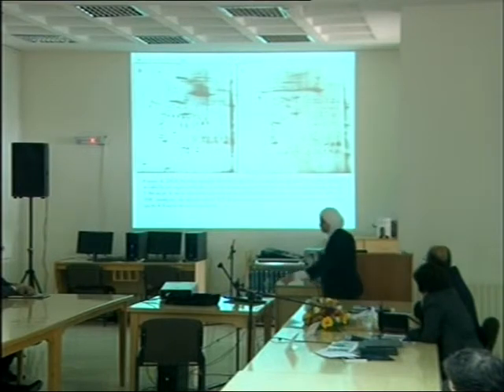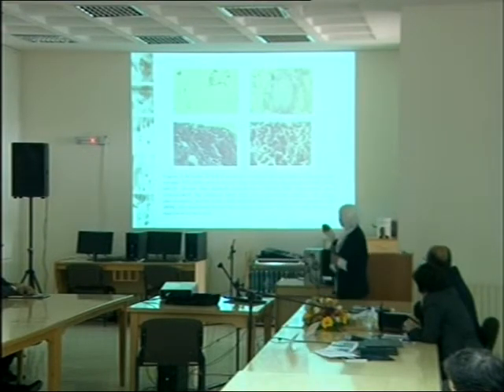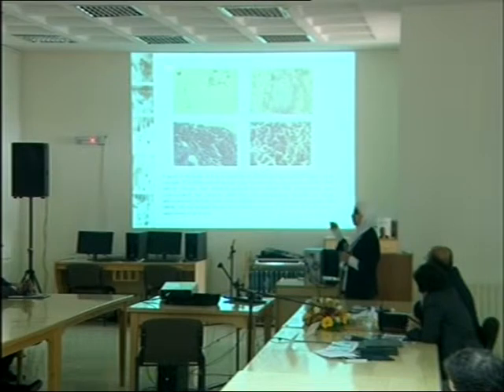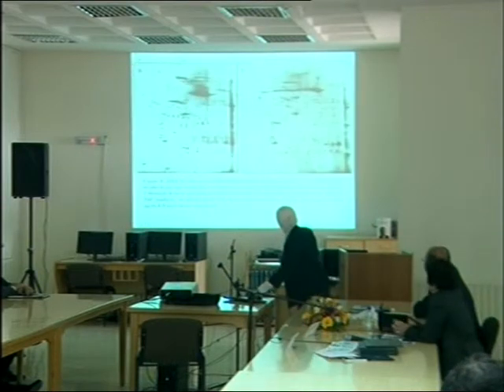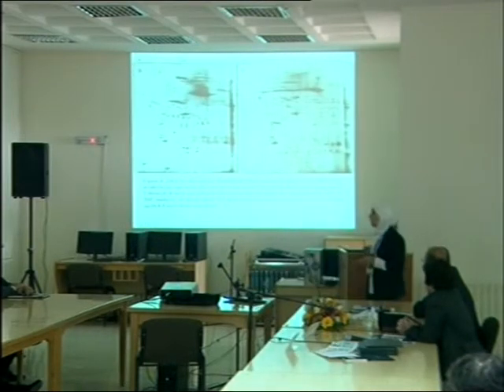In the previous slide, you can see some of the tissues were only adipose tissue. This is the difficulty of having tumor from breast tissue: many adipose tissues could be there, and they will not represent the criteria we want for our samples.